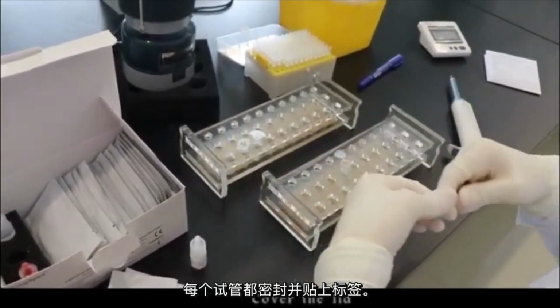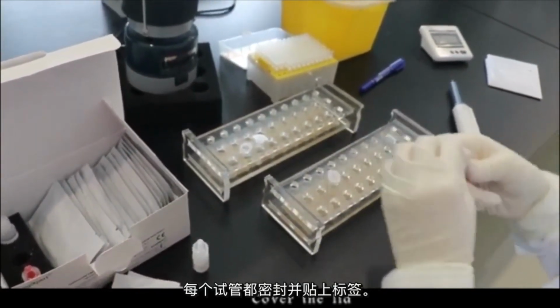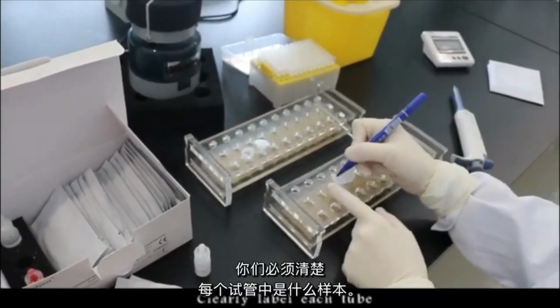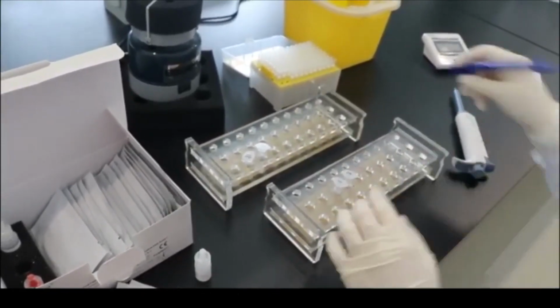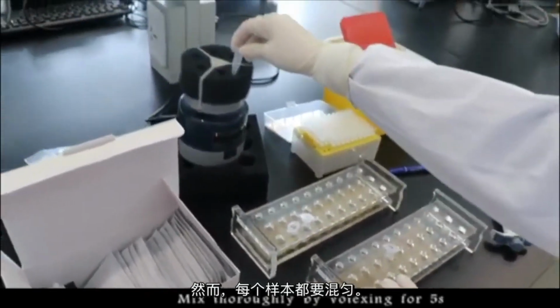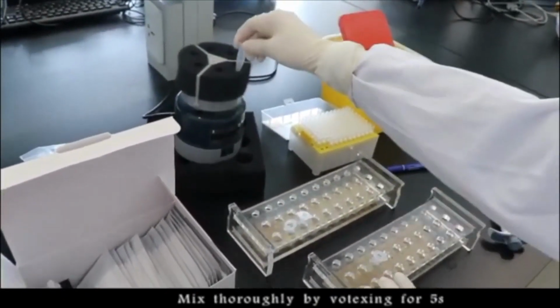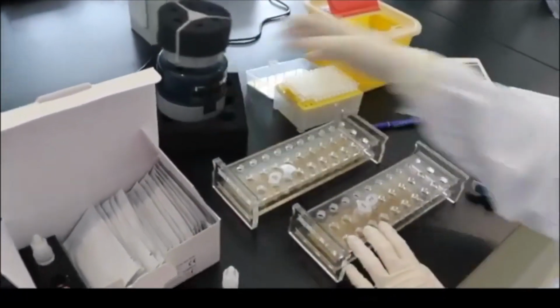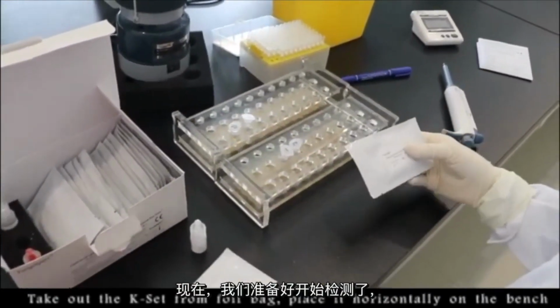Each tube is closed and labelled. It's important that you know which sample is which. And then each sample is vortexed. You're now ready to start the assay.